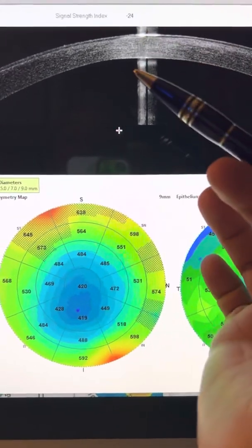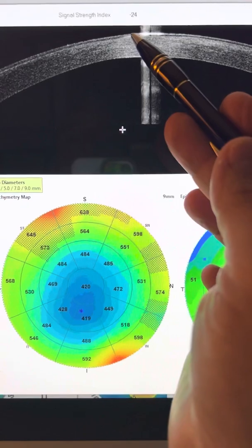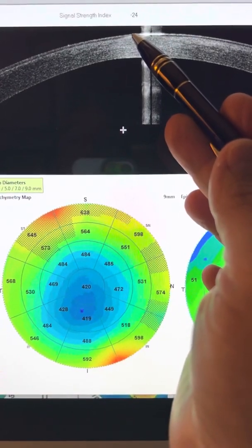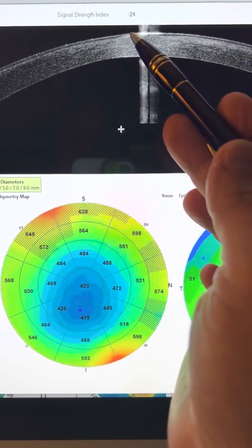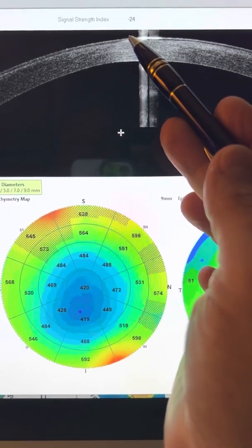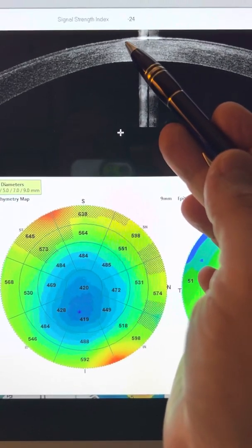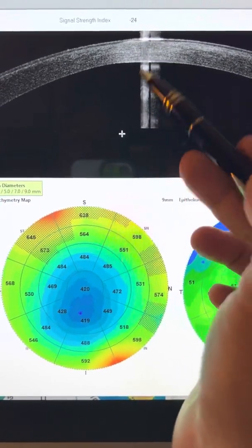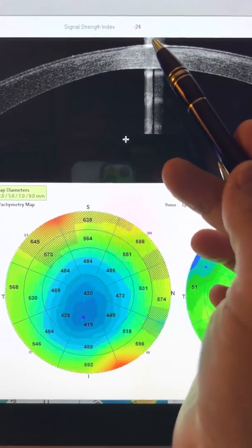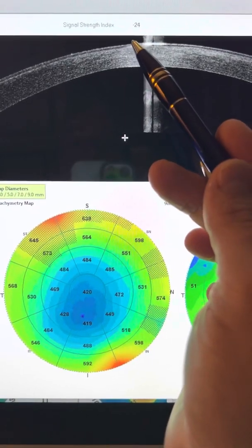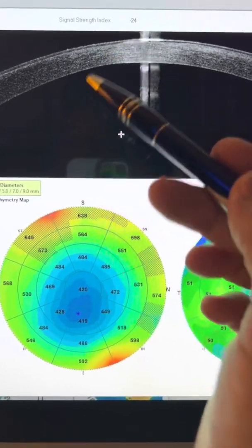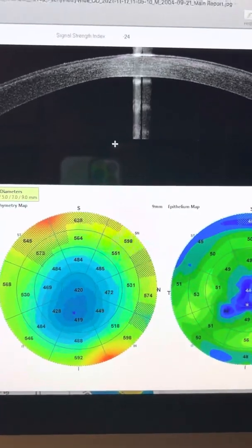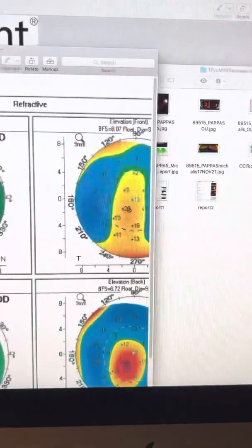And what I want to draw your attention to is the little white spot that we saw in the slit lamp evaluation that we can see here. That it's clearly an epithelial scar. You can see this little bump through the Avanti noise in this image and how the epithelium is much thinner here.